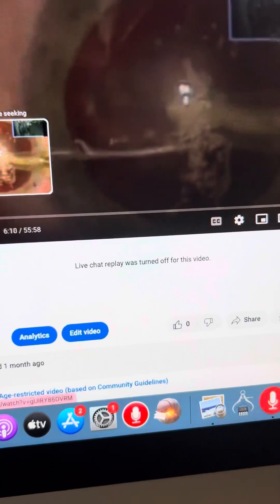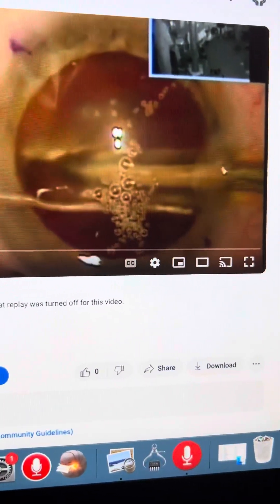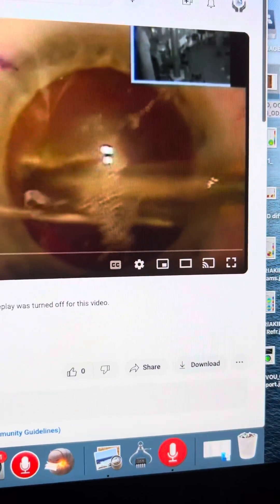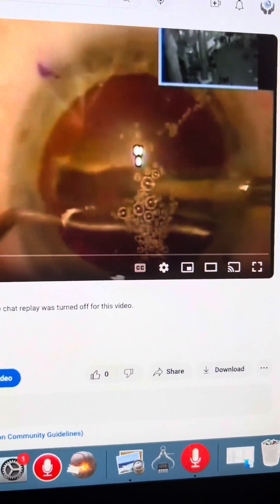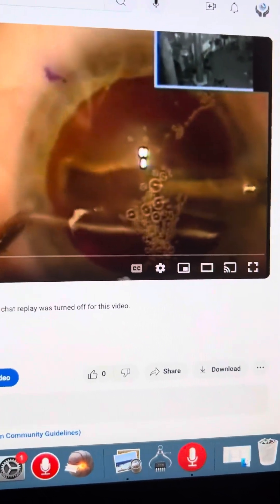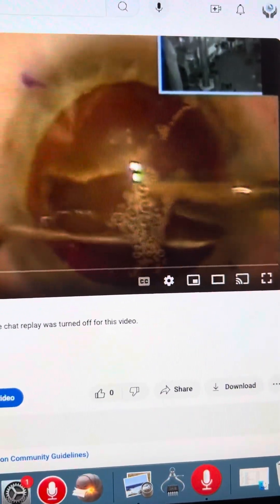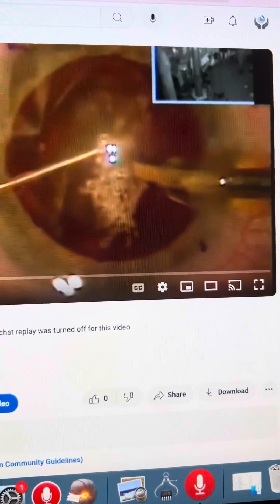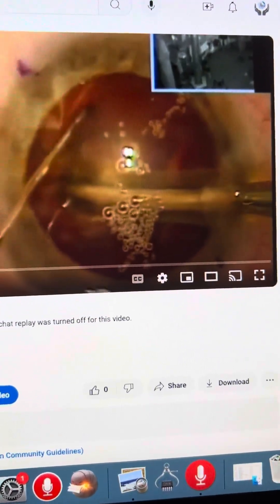This is us doing the capsulorrhexis. Nothing looks very difficult until this point, and until we start to emulsify this very, very dense lens. Just to note here, although we would follow up with a DSAEK procedure, we used close to 600 joules of energy. But I'm still a believer that this is a better option for the patient instead of doing an ECCE procedure, which would have left the cornea with significant astigmatism. It's a very laborious process, and sometimes I wonder why I challenge myself with such cases.